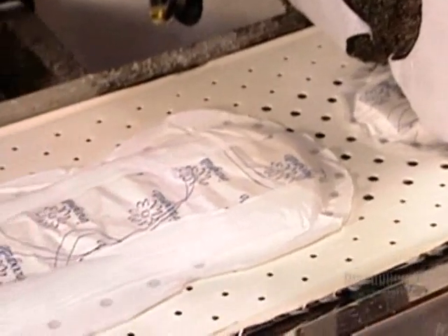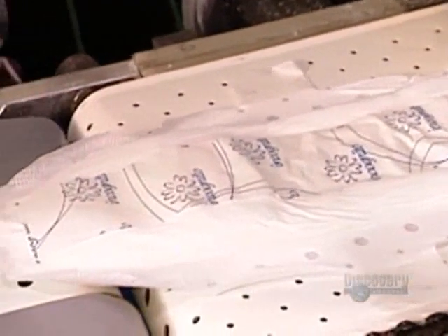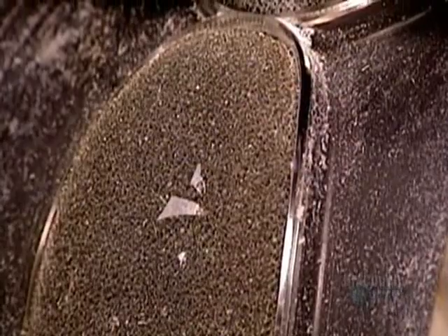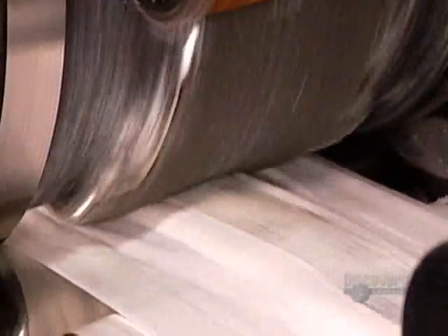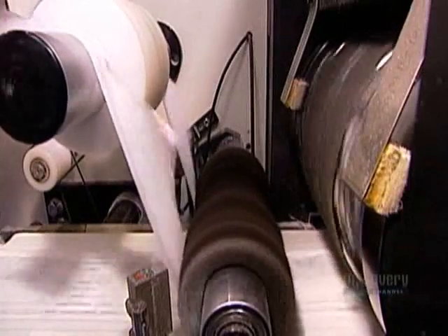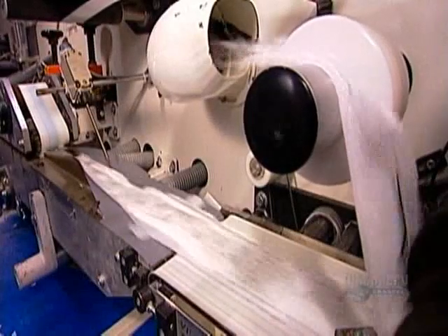The pads are still connected to each other. A cutting die excises each one. Abrasive foam on either side of the die grips and pulls away the material surrounding the pads. A vacuum then sucks this excess away.